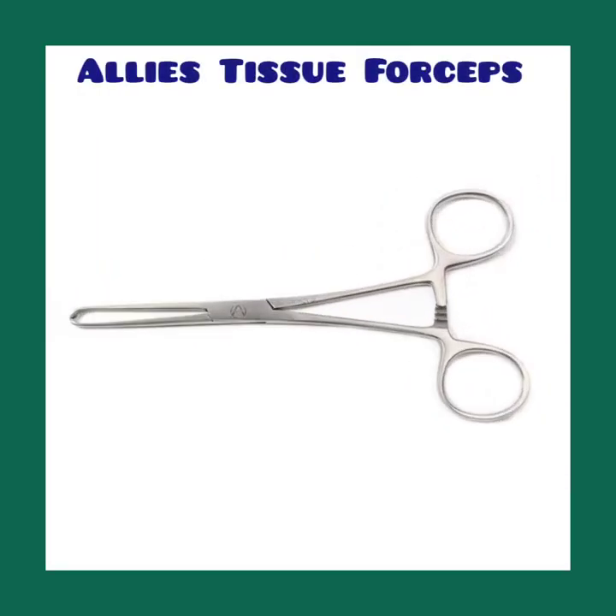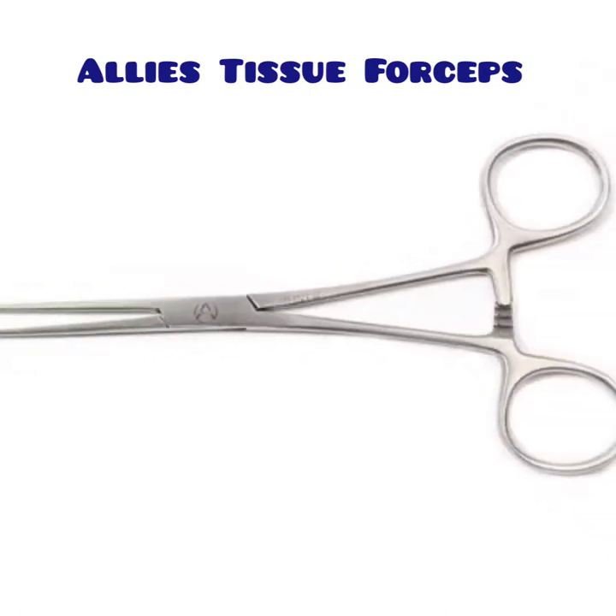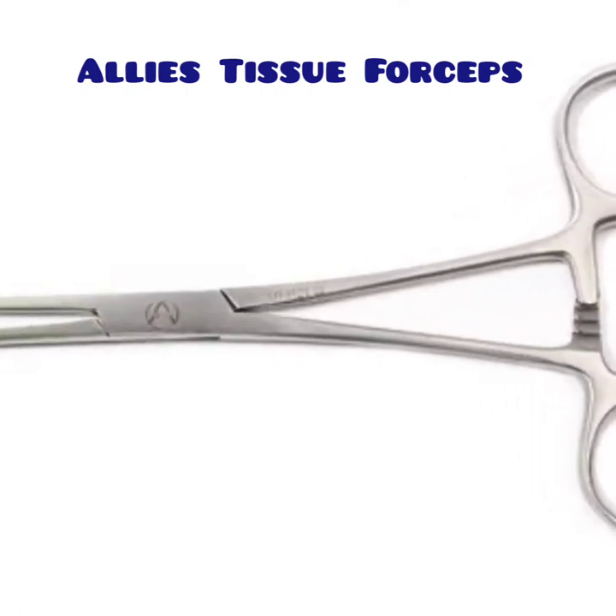Hello all, today I am going to show you Alice tissue forceps.